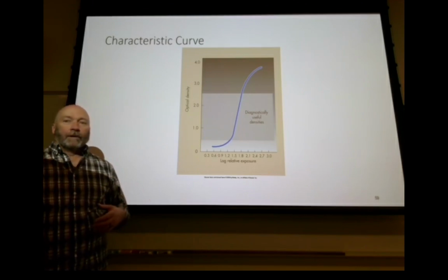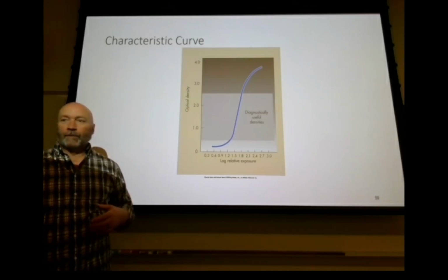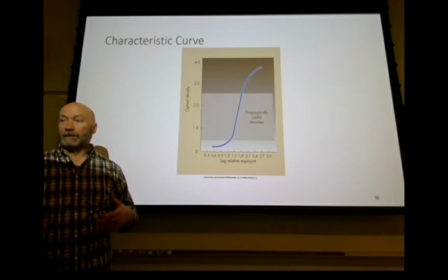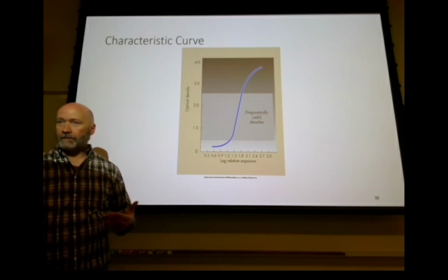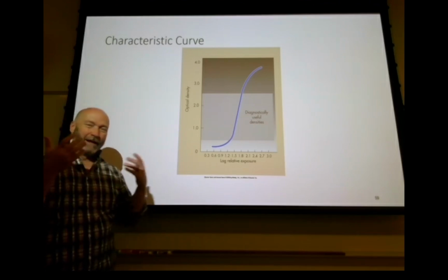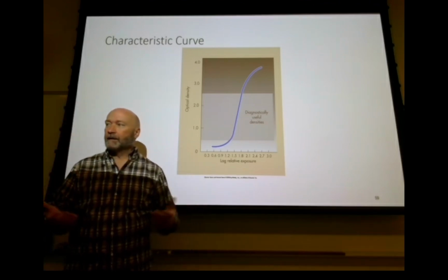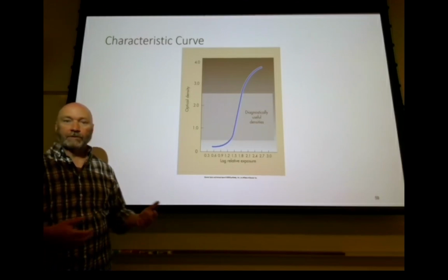In that way, you can better understand how KVP affected your contrast, because if you use a lower KVP, it should display higher contrast. If you use a higher KVP, it should show you lower contrast. So it might help you, it might not, since you're never going to be using films, you're always going to be using digital imaging.